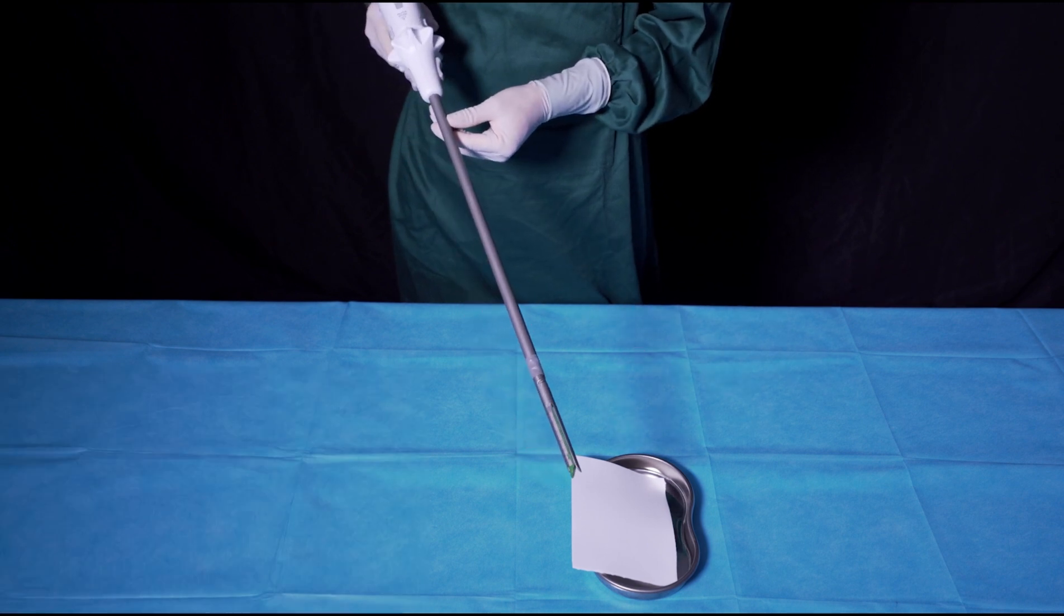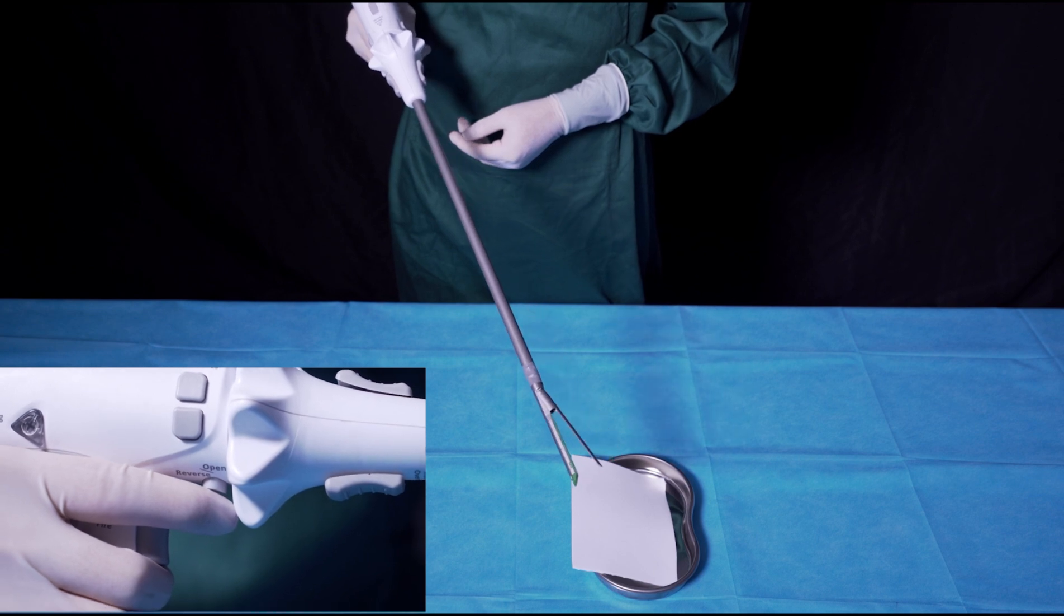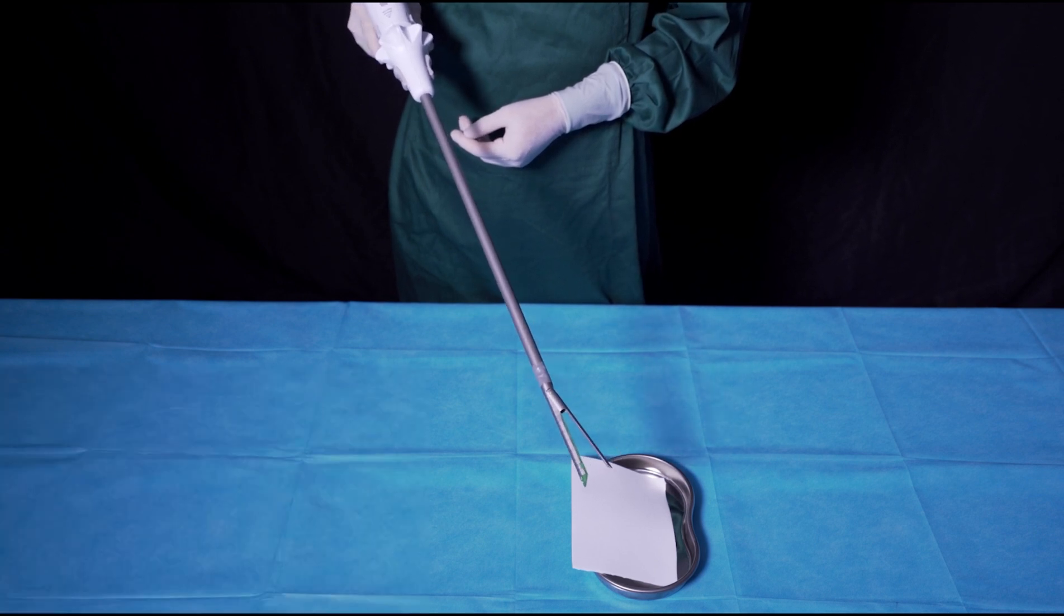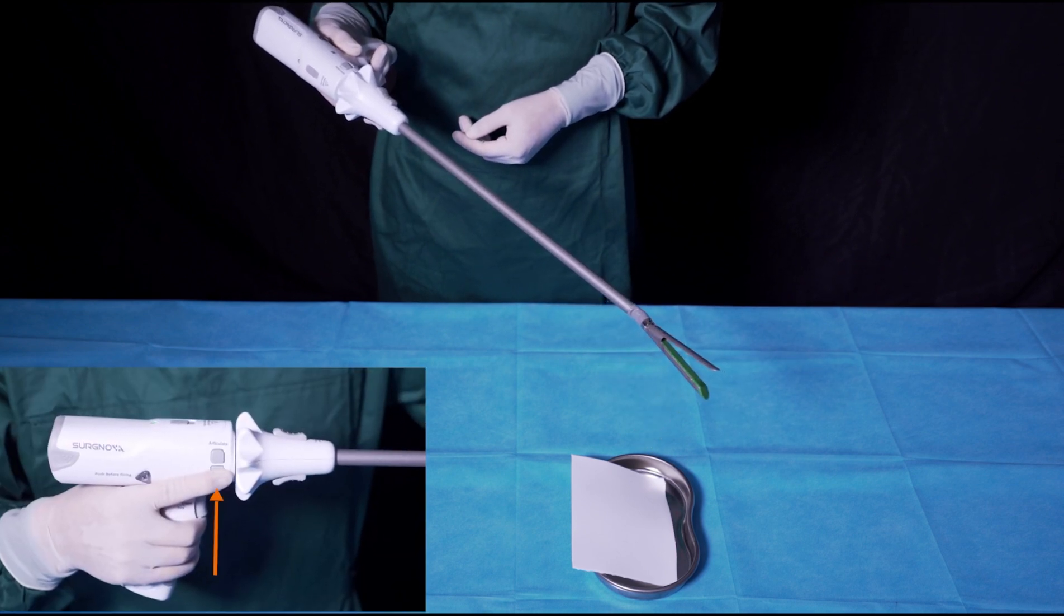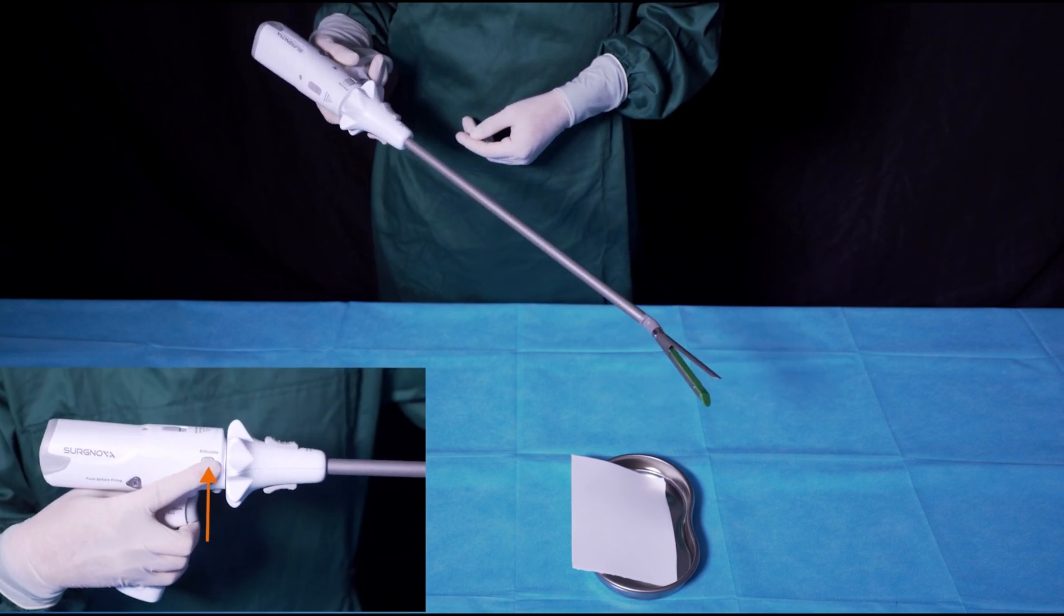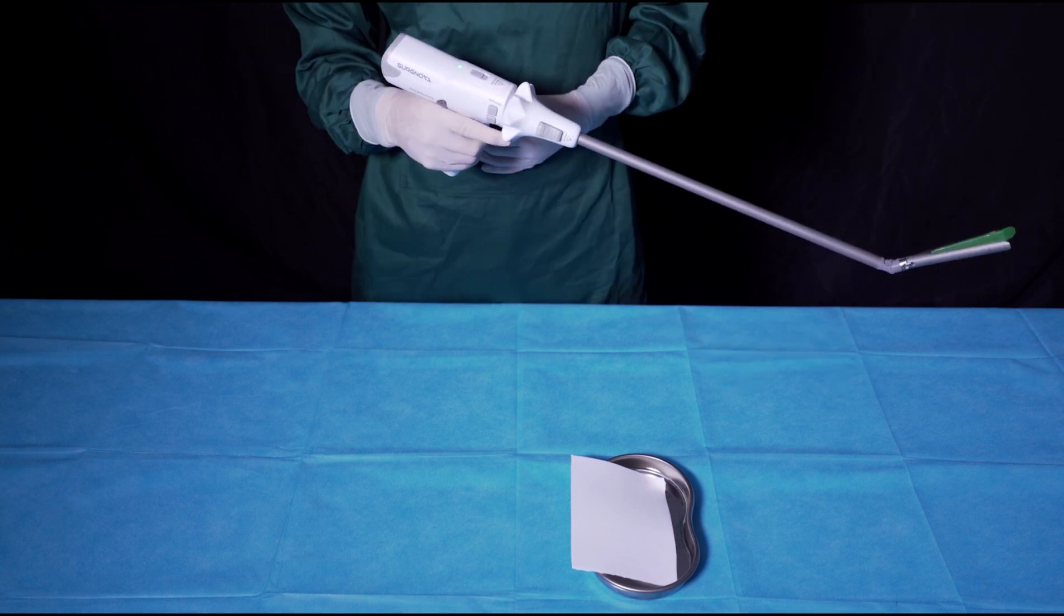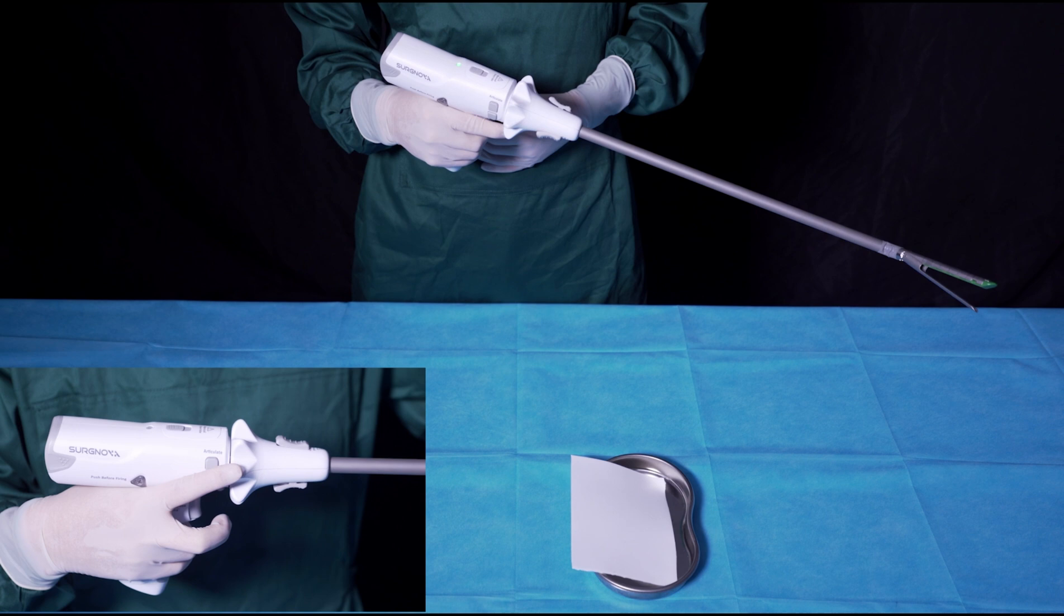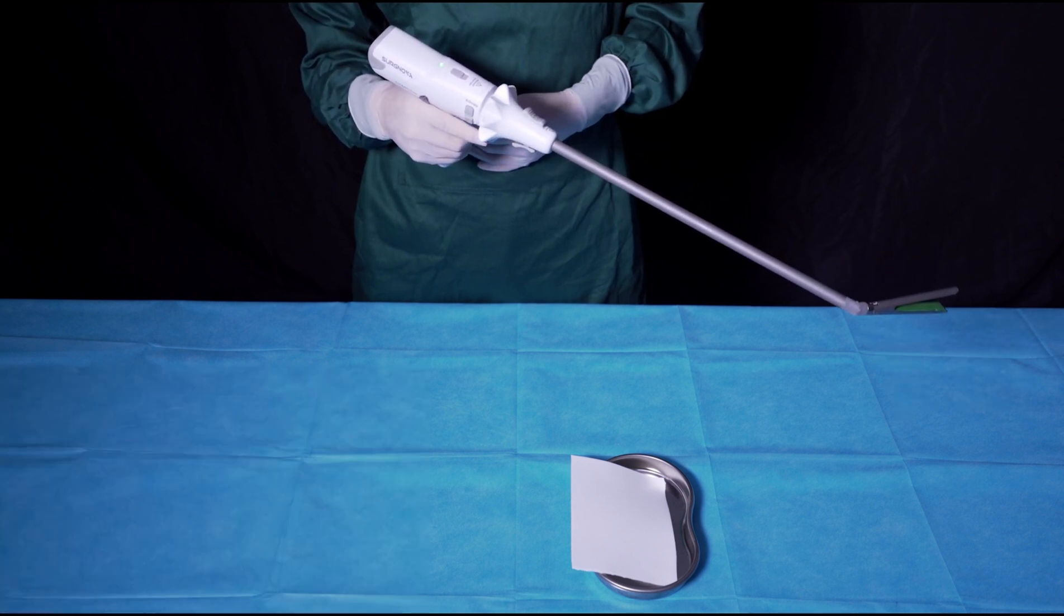After entering the body cavity, press the open button to open the jaws. The deflection button can be triggered to adjust the articulation angle as needed. The jaws can articulate from 0 degrees to 45 degrees to the left or right. If necessary, use the index finger to adjust the rotary joint. The shaft will rotate freely in any direction.